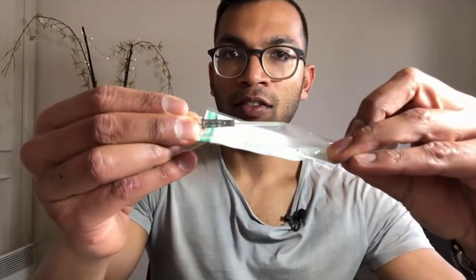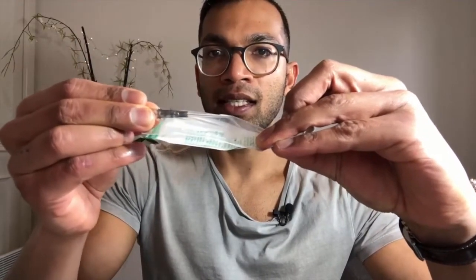Fortunately, the flat bevel surface, hopefully you can see that here, is a relatively non-cutting surface. That's really important to know, which means that even though I can seemingly access it quite easily, if I was to try to cut the top surface of the vein, it's very hard to do so. As you can see there, I am lifting up against the plastic, but because of the angulation and the technology that's in these cannulas, it's very difficult for that to cut the top surface.